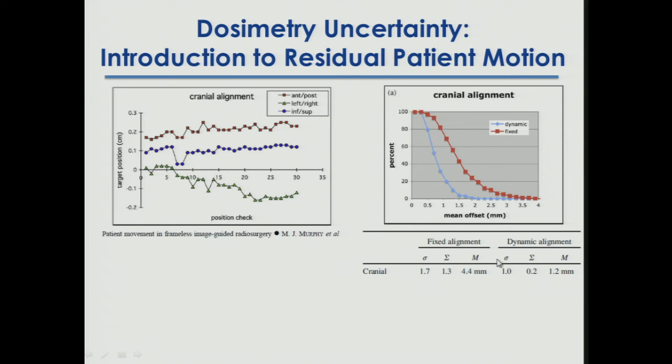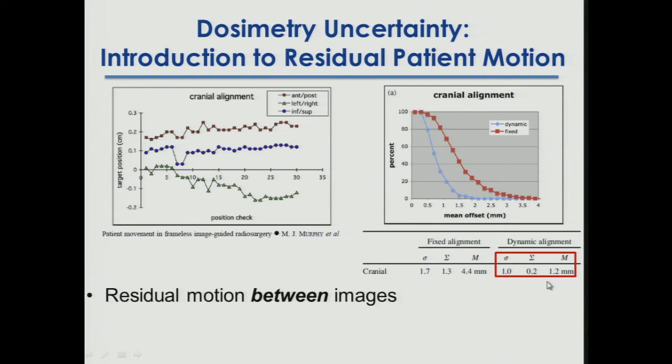This is an older CyberKnife paper, but what I liked is they took all these data points and looked at the residual error and looked at if you don't correct for intrafraction patient motion, you can actually have a very large combined uncertainty, if you assume that van Herk does hold. And if you correct for that, you're actually getting lower, but still above 1 millimeter.